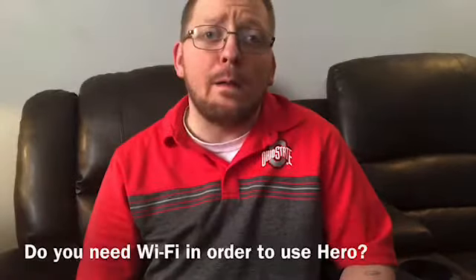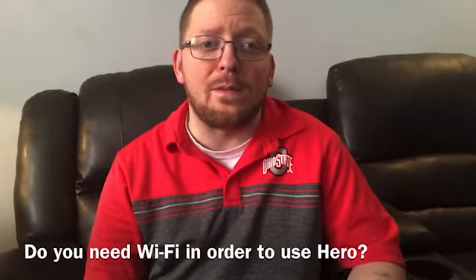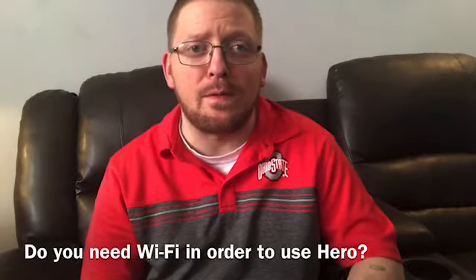Question number 3. Do you need Wi-Fi in order to use the Hero medication management system? In short, yes. You need Wi-Fi for everything to be configured and to use all of Hero's features. However, there are times that you can go without Wi-Fi, but I will leave that to Hero support as they can go into more detail.